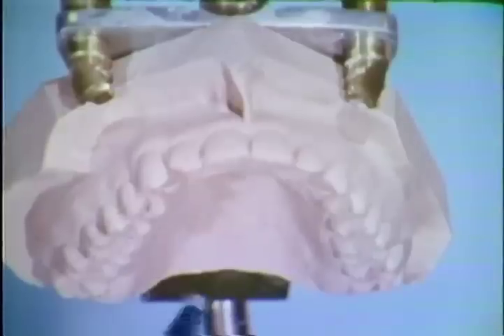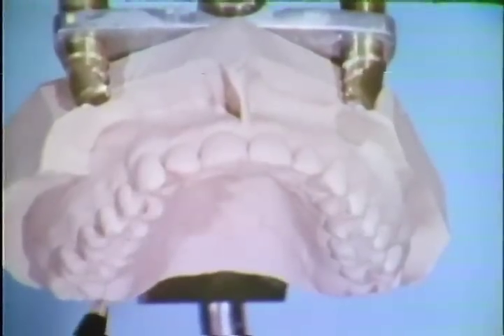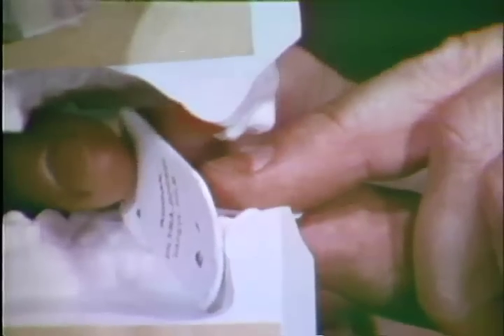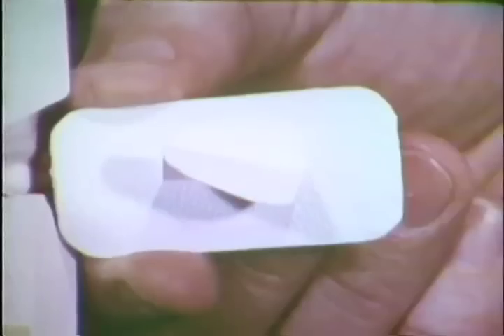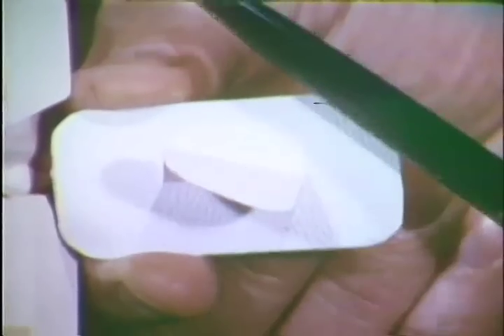This model exhibits gingival hyperplasia in the upper molar area, which may be an obstacle to film placement. Red wax has been added on this model to simulate such a condition. As the film is inserted and the mouth closes, we see that the obstacle displaces the posterior portion of the packet downward. After the exposure and removal of the packet from the mouth, a check of the bite wing shows an oblique distortion. The radiograph shows the result of such a displacement: the occlusal line of the teeth traverses the film diagonally, providing abundant coverage of the lower molars but severely restricting coverage of the posterior maxillary segment. The remedy is to place the film lingual to the obstacle and not allow displacement to occur.